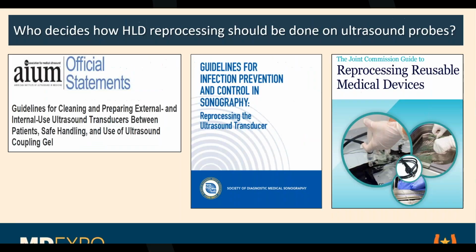Again, let me take a second to say, HTMs are the guardians of the gate for technology coming in. You are the thin blue line between safe use of a device and devices coming in and out of your facility, coming in for the initial installation, but also going out maybe for repair and coming back in. It's supposed to go through HTMs, and so it's necessary for all of the people involved in this to understand what's expected of them and how to think through how I'm going to manage this device while it is in my facility.